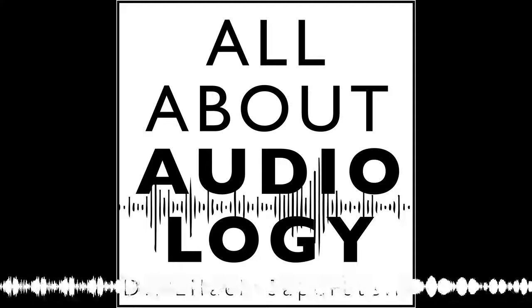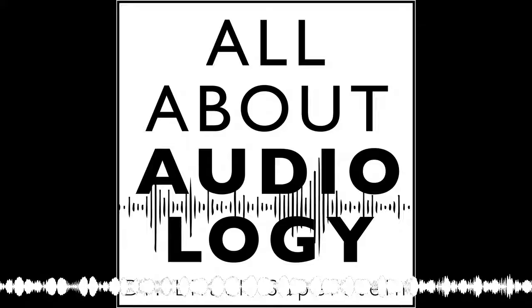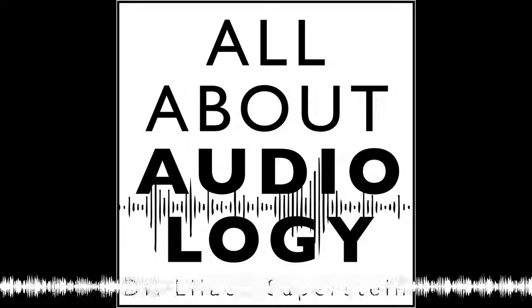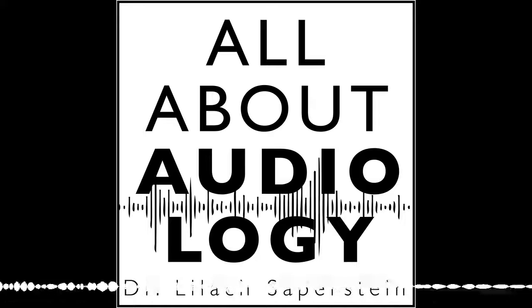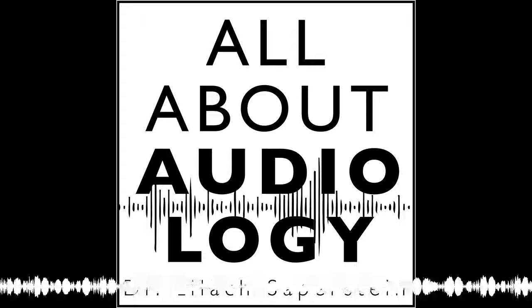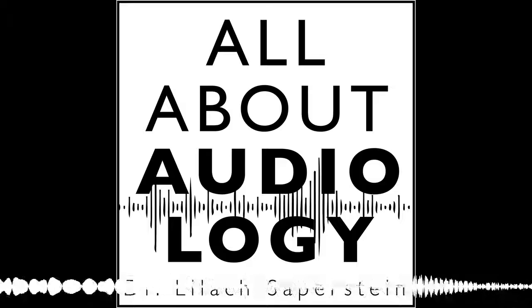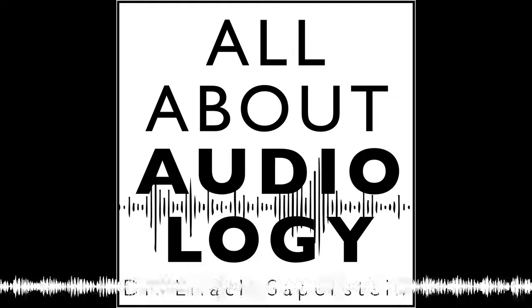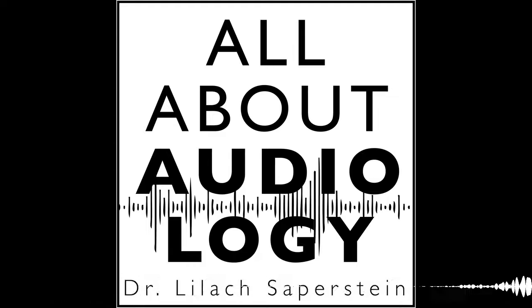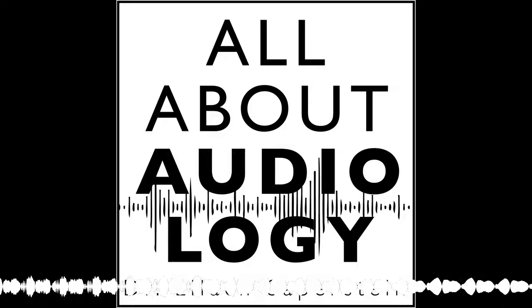And I think one of the simplest things to understand is even using headphones already is such an amazing tool, because you're getting information from right ear versus left ear, which you're not getting if you have a kid in front of you, because you don't know: are you getting both ears? Are you getting one ear? So even that's a simple thing that you think, oh, that's obvious, so we should use those. But you need to have well-calibrated and equal right and left insert earphones or headphones. So that's one of those things.